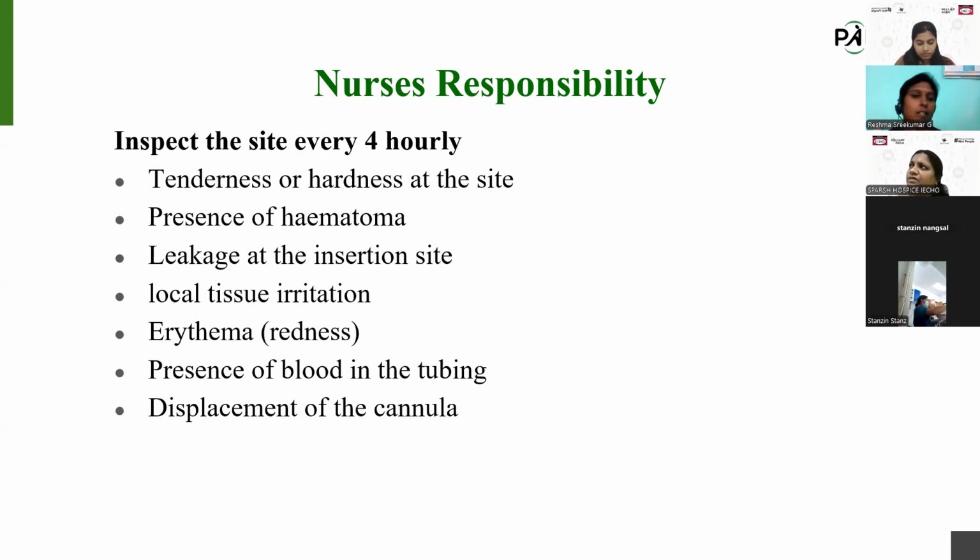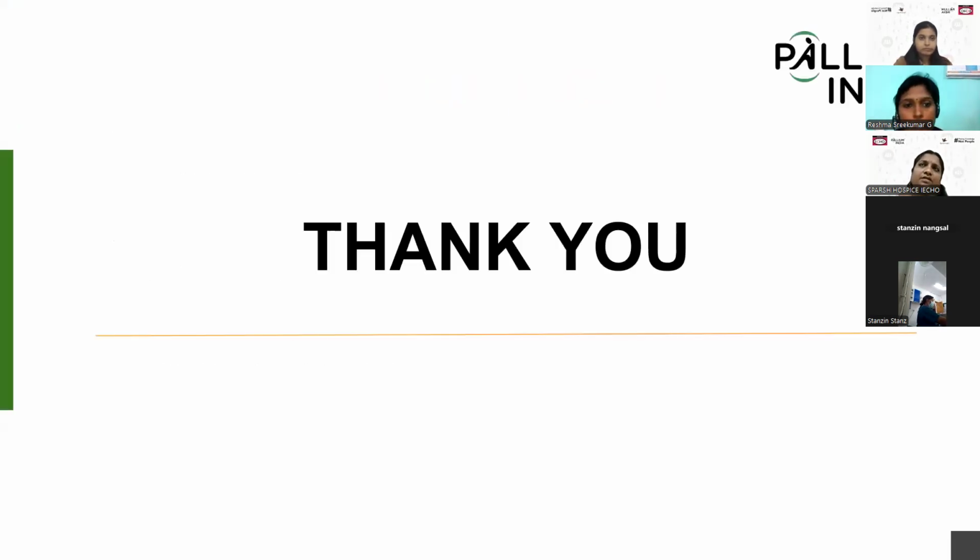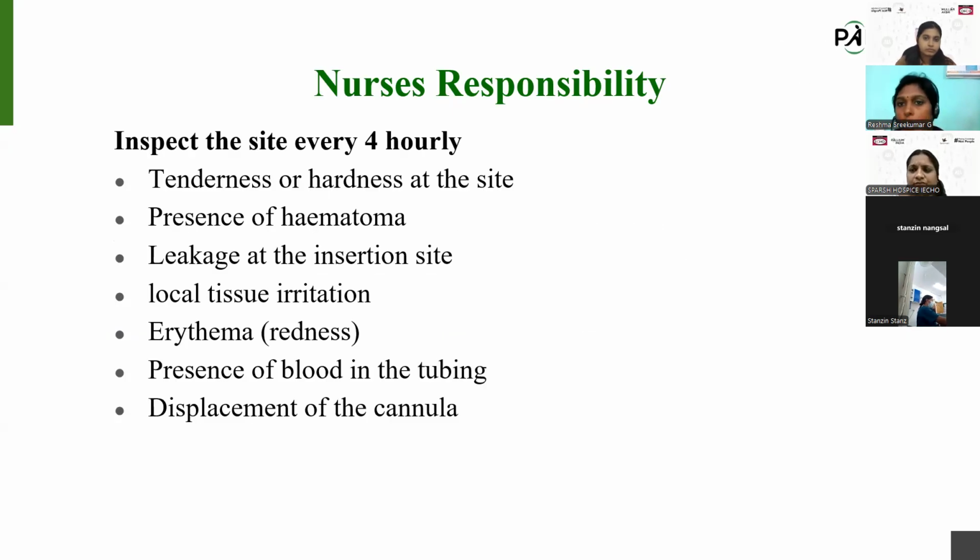You should inspect the site every 4 hours for tenderness, hardness, presence of hematoma, leakage, local tissue irritation, erythema, redness. Is there any presence of blood clots? Is there any temperature variation and displacement? And this is all about subcutaneous infusion.